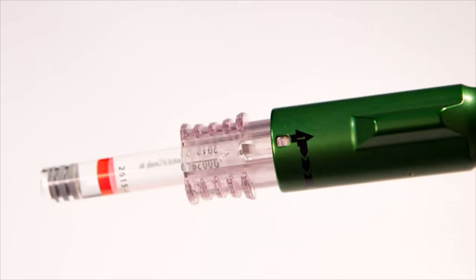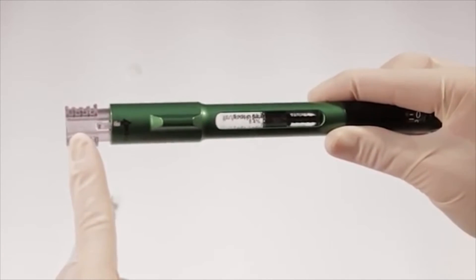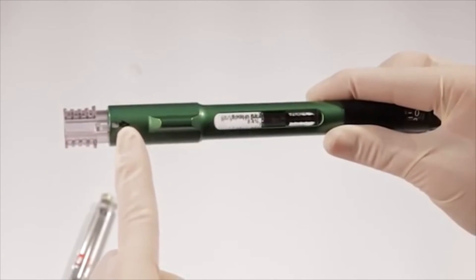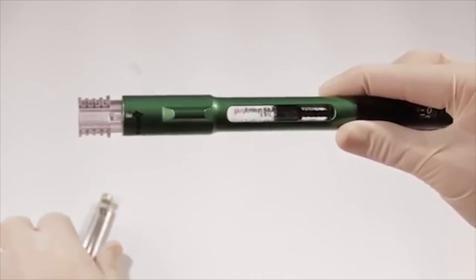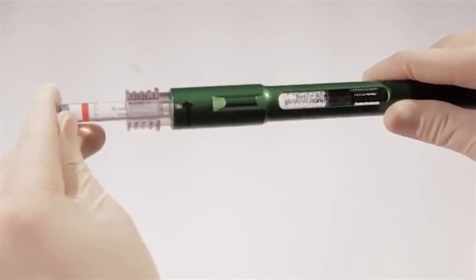If you try to load a cartridge at the number two position, it attaches to only one of the connector's transfer tubes, and the plunger will come out during mixing. When loading a 1.8-milliliter cartridge, make sure the connector is in the number one position and that the 1.8-milliliter cartridge is pushed all the way into the connector to puncture both transfer tubes.